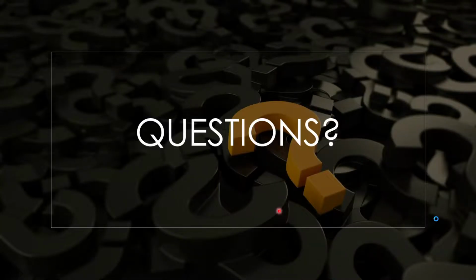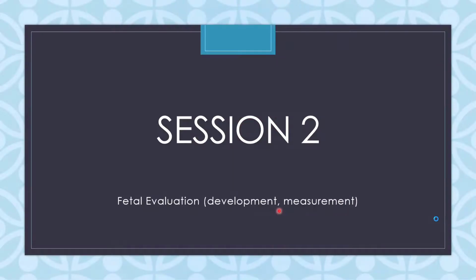Okay, so I want you to take a moment and pause the video, write down any questions that you may have up to this point, and if it's something that needs to be passed along to me, I can help answer those questions, or your nurse manager or sonographer can answer those as well. Okay, now we're going to get started on session 2. This is where we're looking at the fetal evaluation, looking at the development, and also the measurement of the fetus.